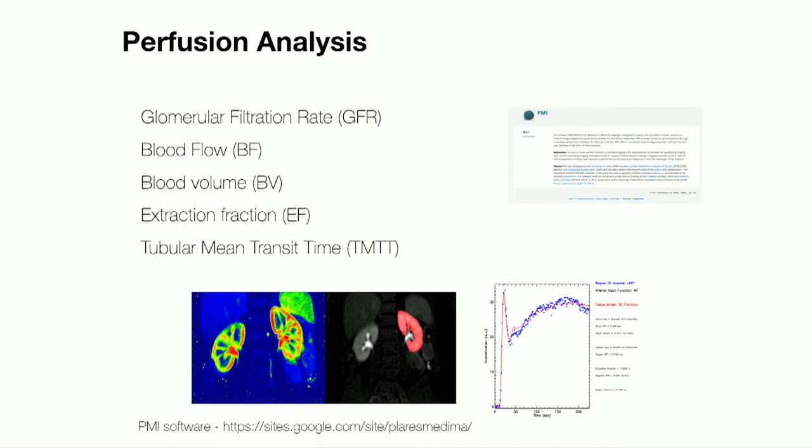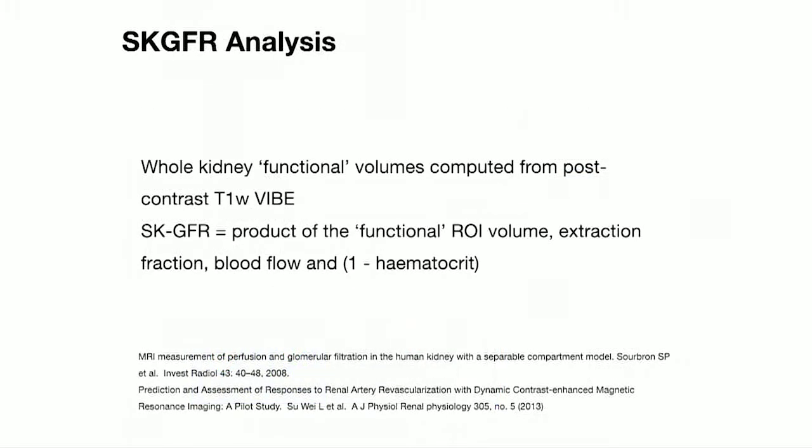We then put this into a MATLAB derived sort of thing, which we do the GFR and blood flow and blood volume from, and we can get single kidney GFR. The good news I heard the other day just before I left Scotland is that we've got a DMSA shortage. So at the moment, a lot of these patients have been getting DMSA anyway, and they haven't really believed our MRI results, even though we've shown that they are the same. But with the DMSA shortage hitting, hopefully we'll be able to just completely take over that part of the service.